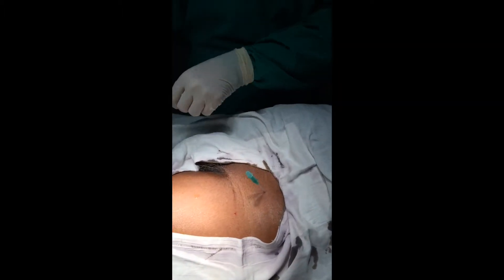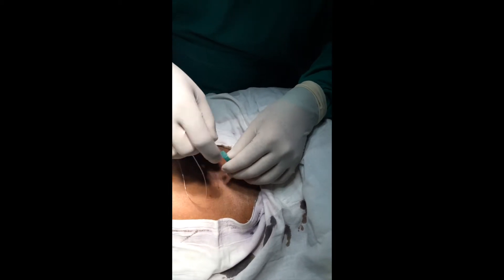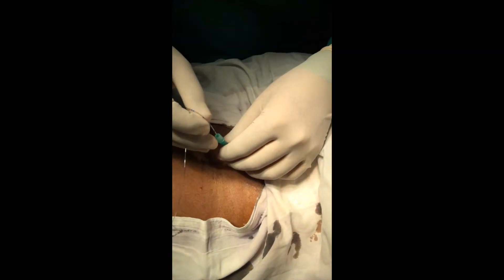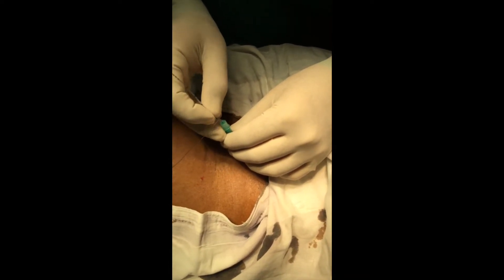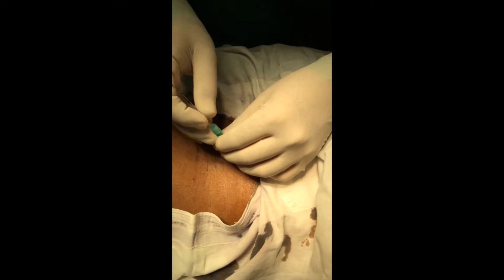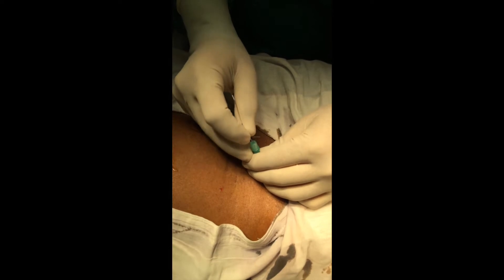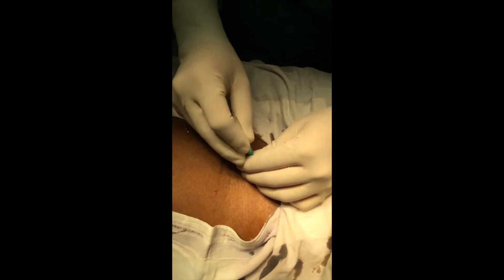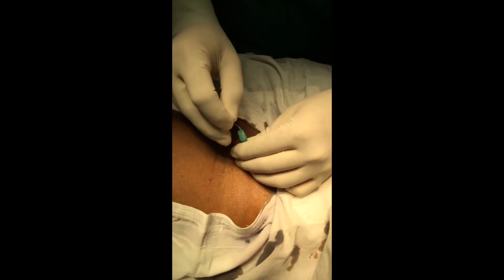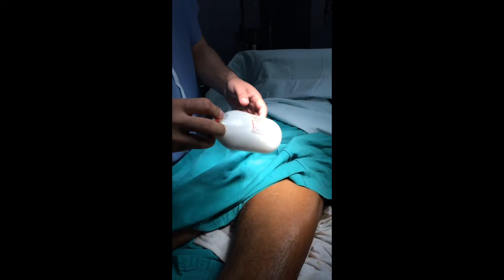Now depositing 30 ml of local anesthetic. Then I have inserted the non-stimulating catheter — there should not be any resistance at all. If you get some resistance, rotate the cannula and it should go very freely. It is going, going, and further going. We are inserting four centimeters beyond the cannula tip, then removing the cannula.